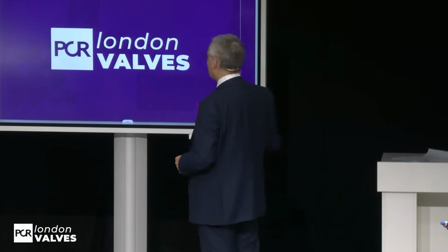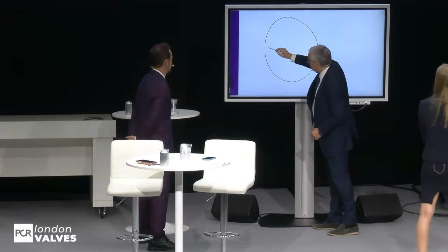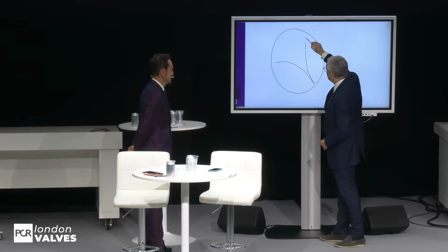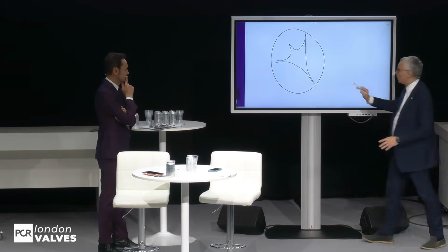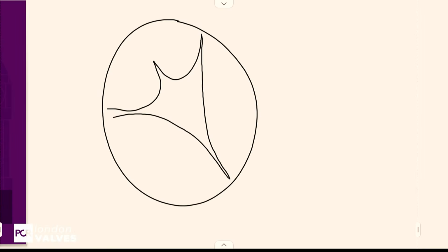So how do we get this here like this? I think we all agree that the first clip is going to be anteroseptally placed. So now you see my skills. We don't know the posterior, but usually this is a very common, let's say, posterior. It can be one or two. Anyhow, we focus on patient number 2. For patient number 1, probably you are obliged to go to both leaflets because everything is bulging.